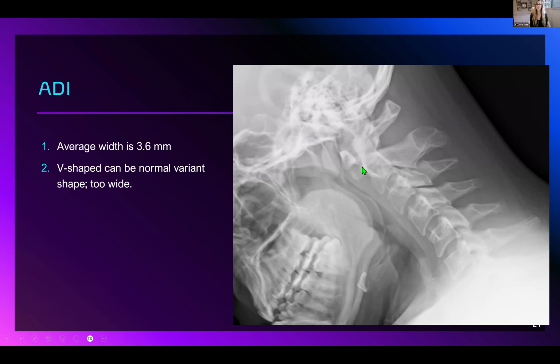I see that very clearly at the bottom. It's wider than a typical V, like you said, more of a sharp point at the bottom that you would notice. It doesn't close down. Usually it typically would. If it was a normal V shape, I would see the border come through here a little bit tighter, and it's like, oh, that's normal. But this, it's all opening up. Yeah, I see that. Good thing to look for.